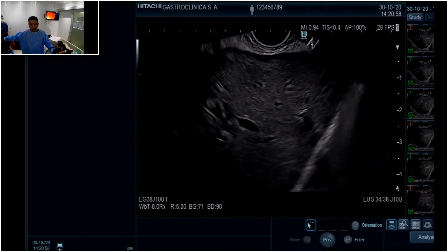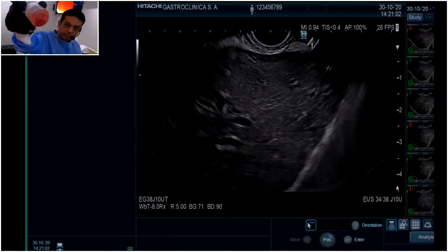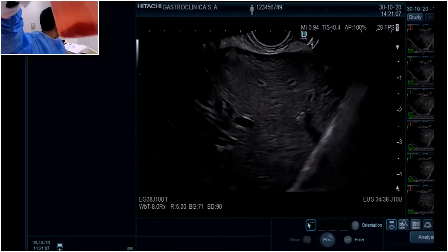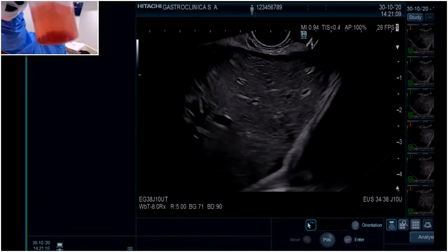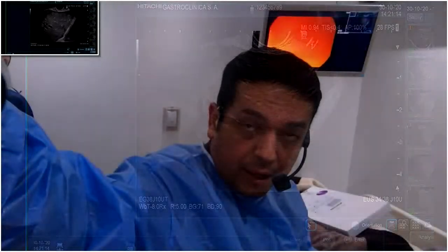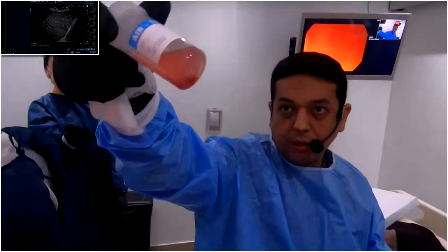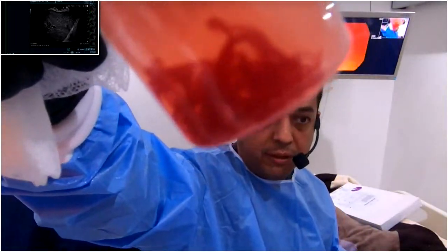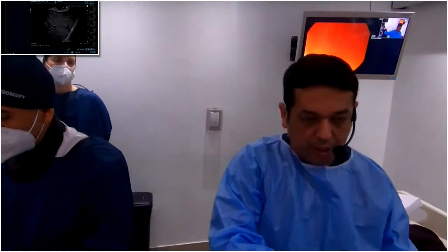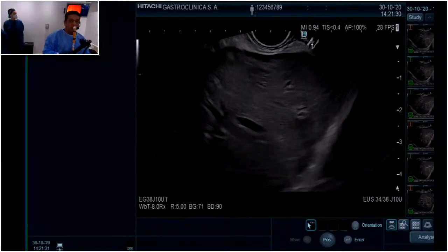So now I will show you the quality of the needle. Huh? Look. Without aspiration. So I think I have very good tissue now. And I take my biopsy from direct target. Okay. So I don't believe that I need another passage. So I finish. I continue with my needle here, with my needle inside my scope. I don't know if we can show.